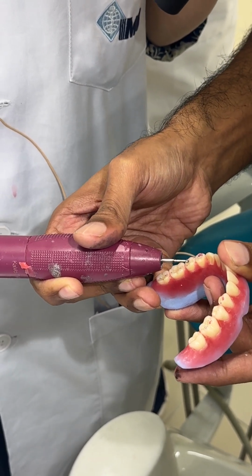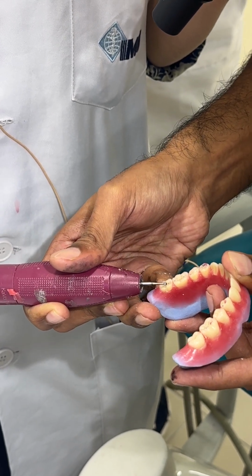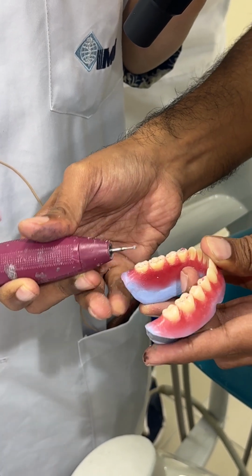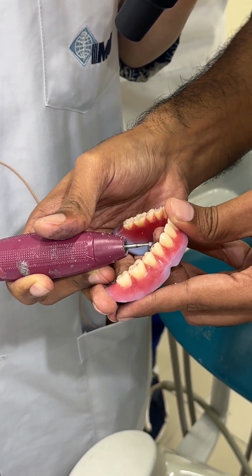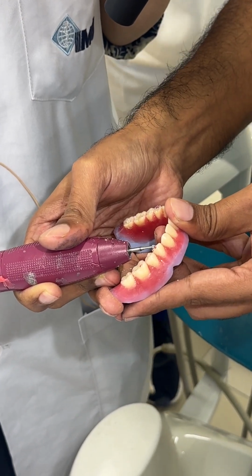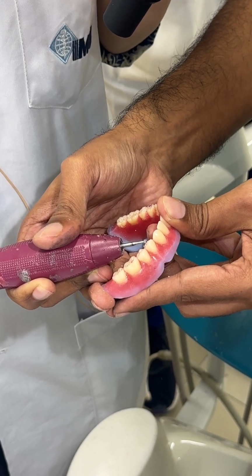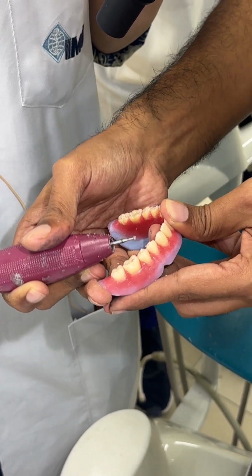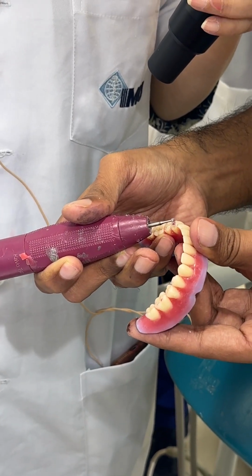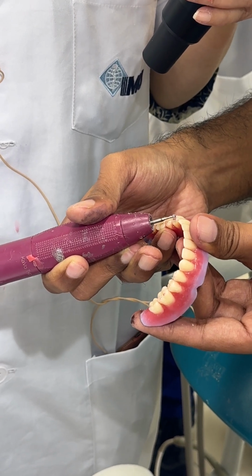I can remove it like this. Similarly here also. This is the functional cusp, but it's very dense and filled out, so I can adjust it by trimming a little bit. So next time when we introduce the articulating paper, I will see a very ideal bite over here. As you can see in the canine also, I have too much lateral excursion. The canine one, I can also adjust.